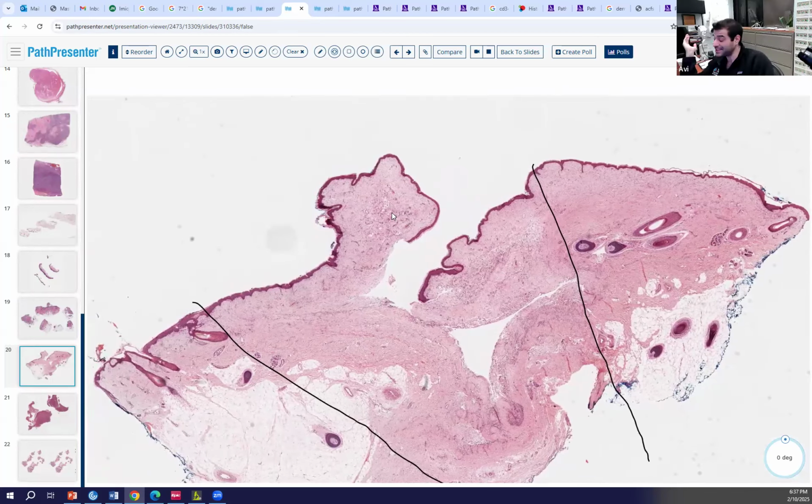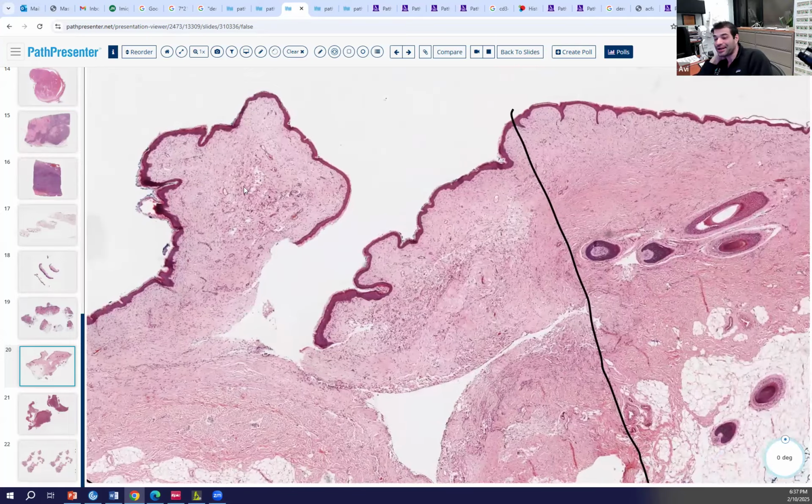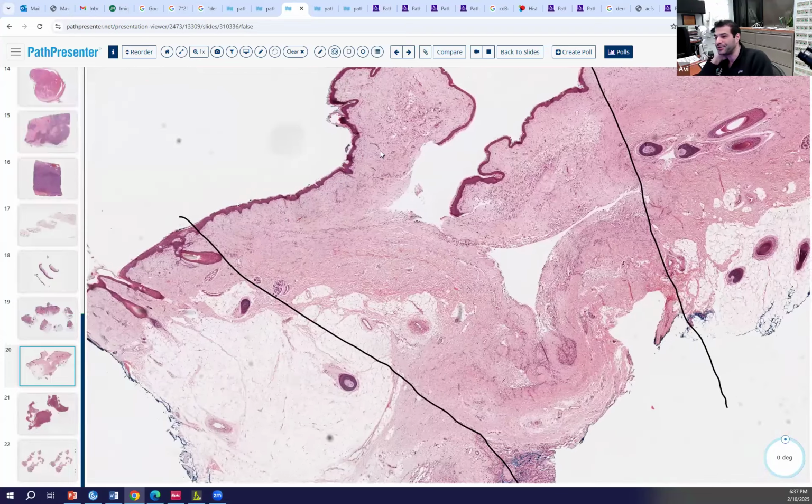Alopecia? No, I don't know. This is a scarring alopecia. It's a type of scarring alopecia. In this case, it's a congenital scarring alopecia. We don't see this very often because it's very rarely biopsied. But you're right. It is a hair collar sign. I just want to caution you against just seeing hair, no hair, hair, and concluding hair collar sign.